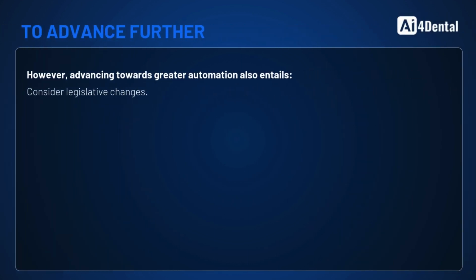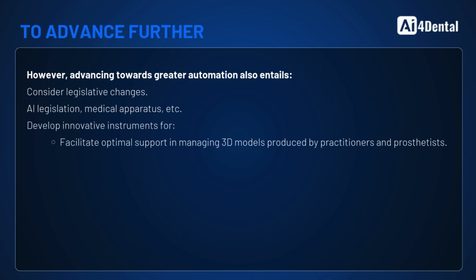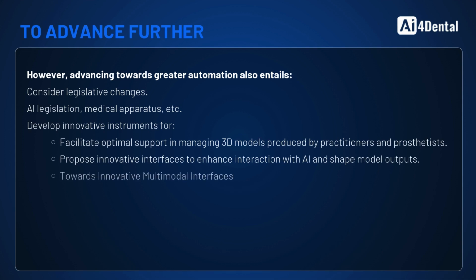As automation increases, it is vital to consider evolving regulations, such as the AI Act and medical device standards. Tools for validating AI-generated results will also be essential. Finally, interfaces must evolve to be more intuitive, incorporating modalities like voice control. Multimodal tools will play a key role in shaping the future of AI in dentistry.